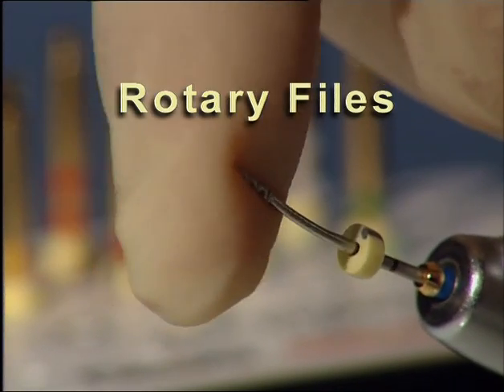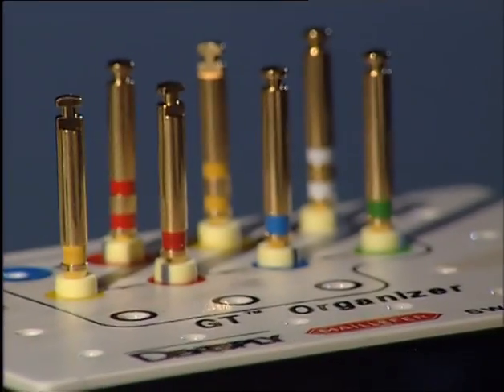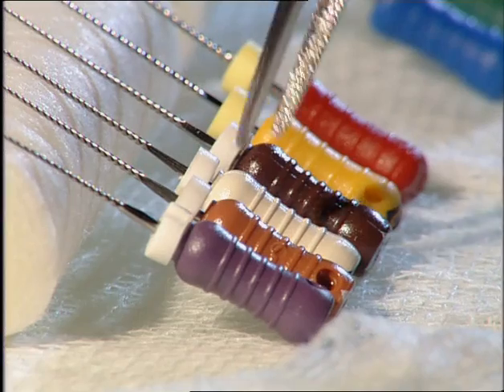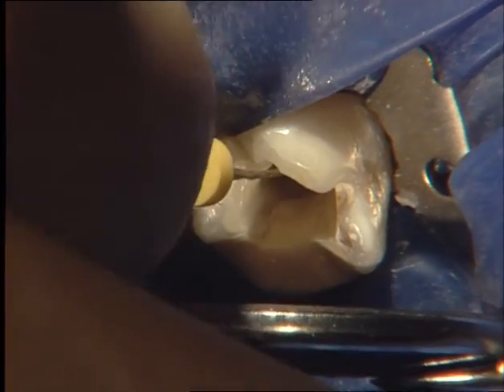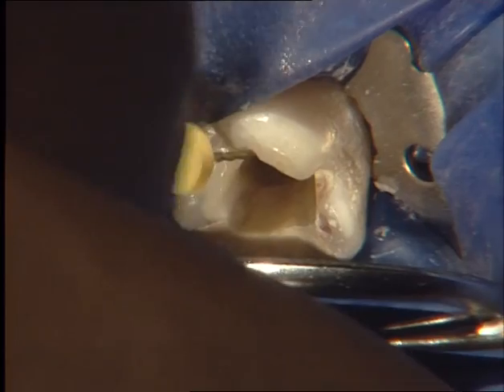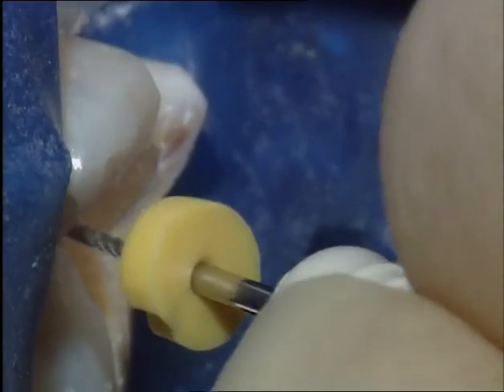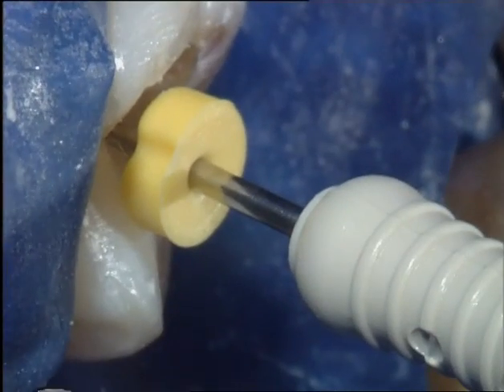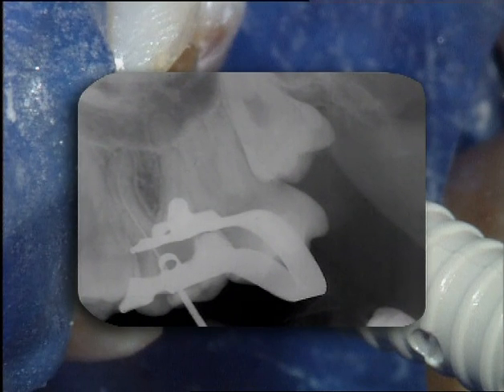Due to their superelasticity, instruments made of nickel titanium allow even the less trained dentist to shape curved canals without apical blocking or tearing. Nickel titanium can be effectively used as a rotary root canal instrument in moderately curved root canals. Before using rotary nickel titanium instruments, the path to the radiographic terminus should be established with the number 15 file during initial apical preparation. With this instrument, the initial length is controlled.